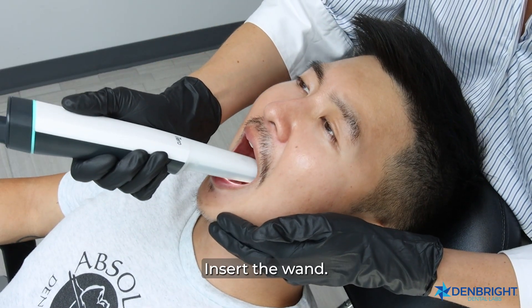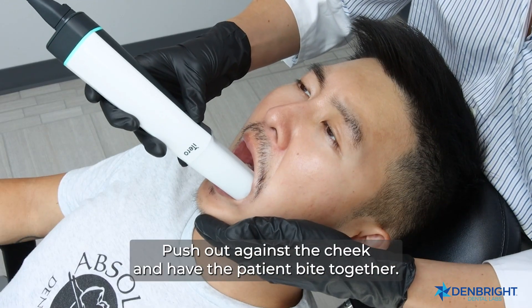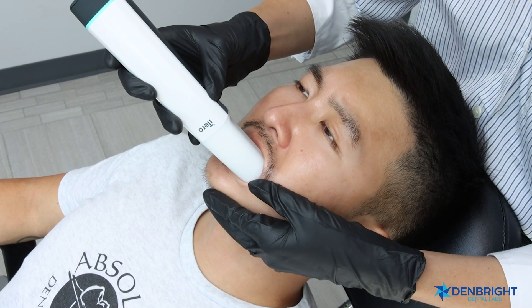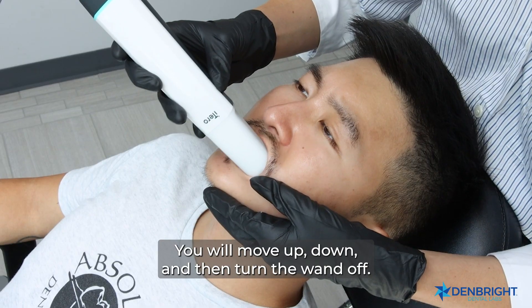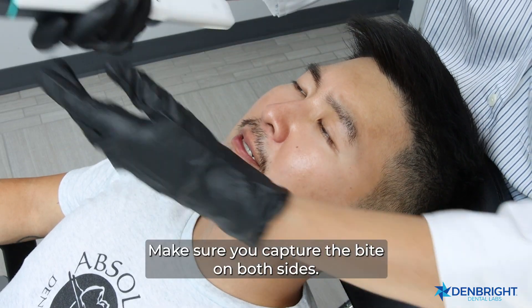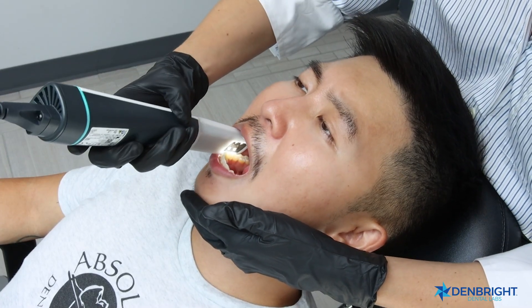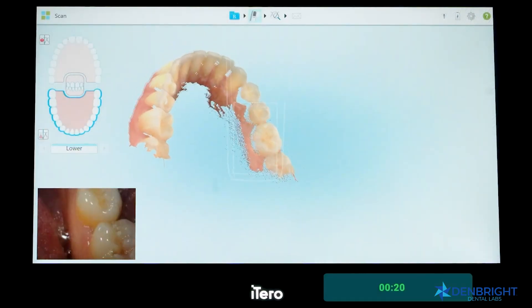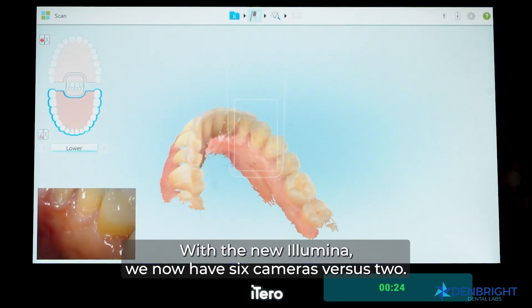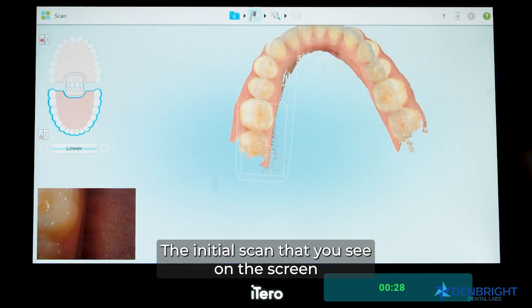When capturing the bite, insert the wand skinny side in and push out against the cheek, then have the patient bite together. Move up, down, and then turn the wand off. Make sure you capture the bite on both sides.